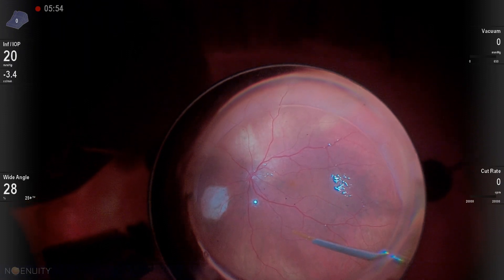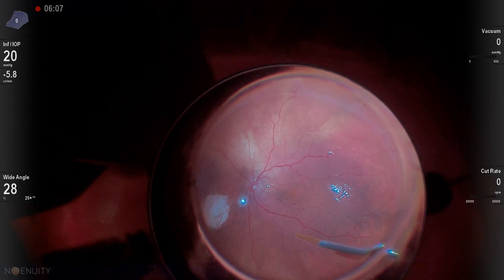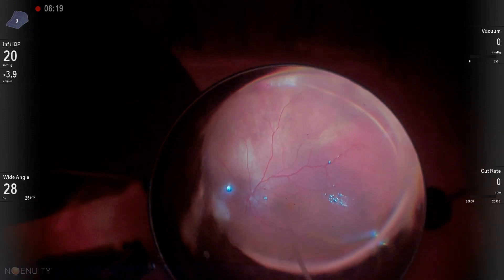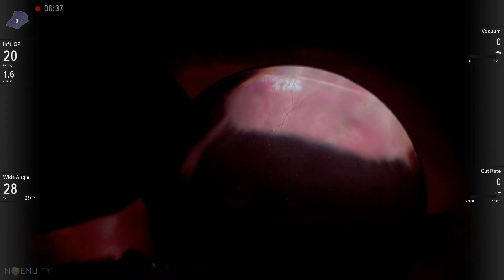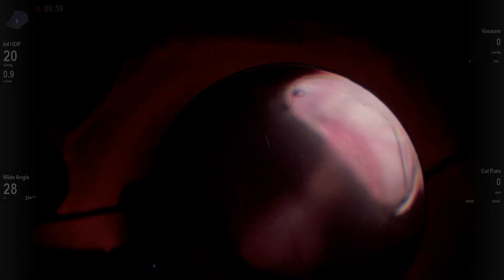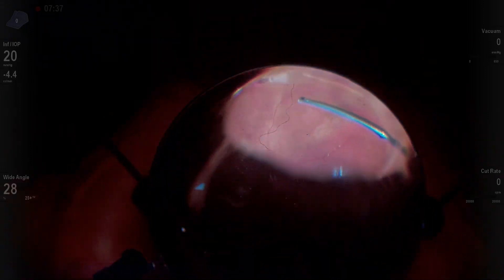Especially early on when I'm filling the eye with PFO, I want to be sure to turn my pressure down to 20. I'm also not going to be infusing PFO with this dual-bore cannula directly at the macula — I'm going to always be aiming away from the macula so that a jet of PFO doesn't create a break in the macula. What I found was that peripherally there was still some residual subretinal fluid even with about a 70-80% PFO fill. I rotated the eye around to see if I could squeegee out some of that subretinal fluid, but wasn't really successful with that.